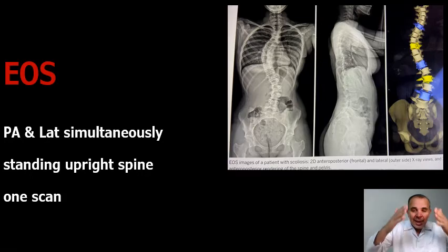Then it's one scan, and it's of course non-invasive, and it's a very low radiation dose for our patients.